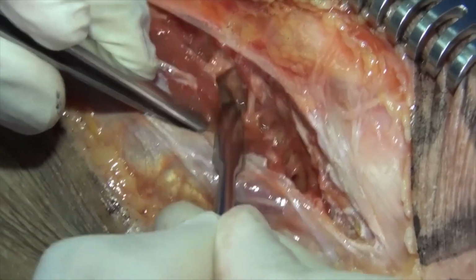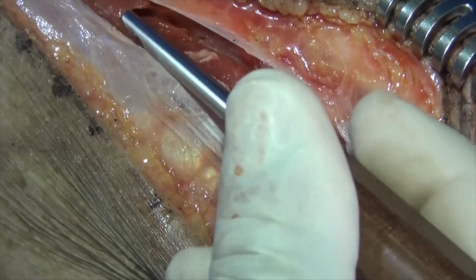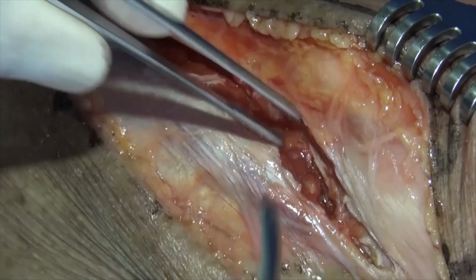So you can see now that we have exposed enough. The rest of the plate you can slip in percutaneously here. You don't really need to do anything further.